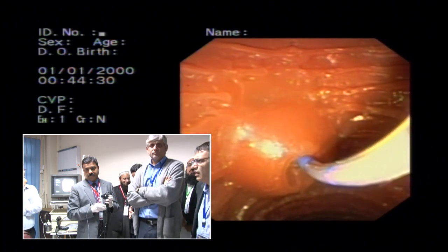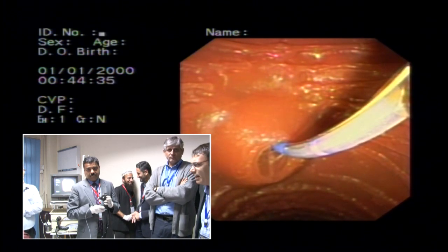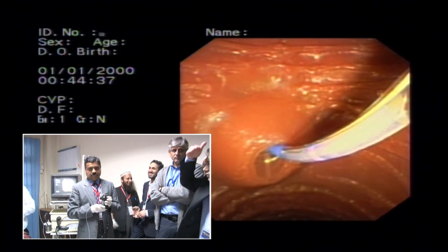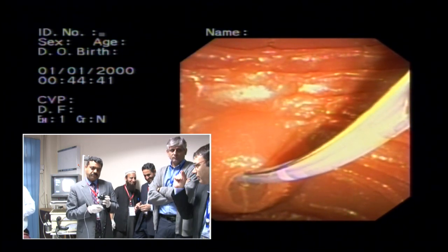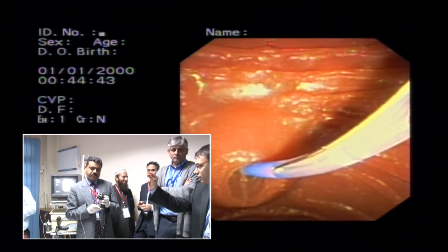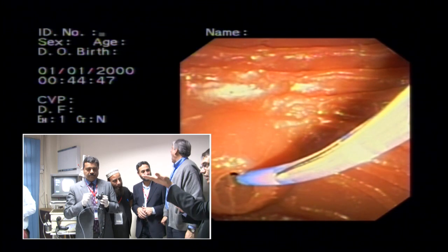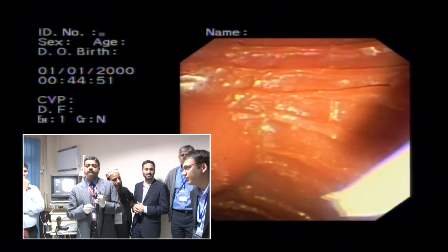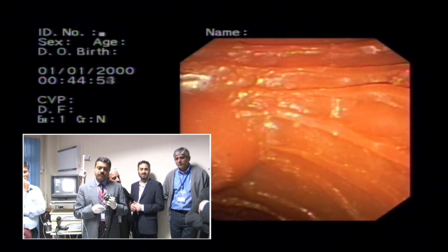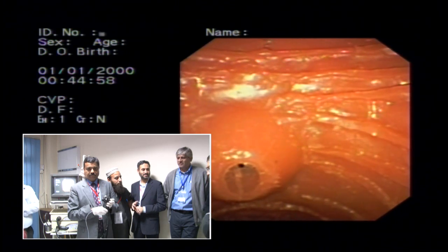Okay, what I can imply is like if your position is like you can get into the right position, ampulla just is very high and you just barely see. I know what you're talking about. In that case, you just bring a tip of the scope out, you engage the ampulla, and then you use elevator, and that just straightens out. Yeah, you do use that. But how often do you need that? It's very rare, not too much.